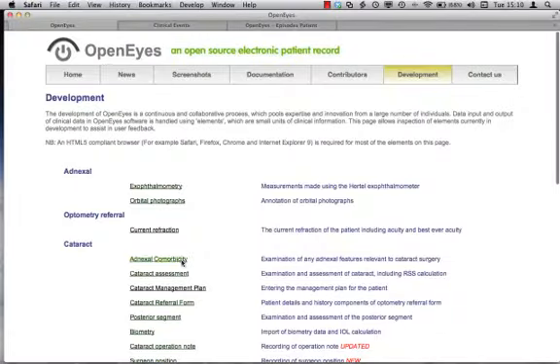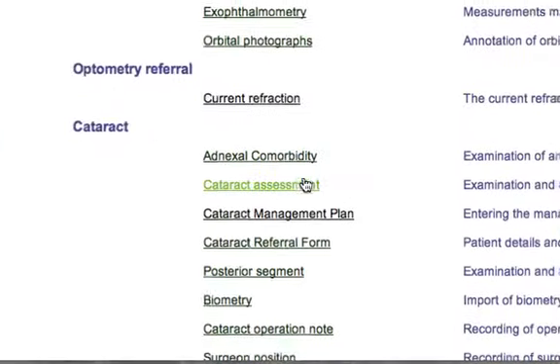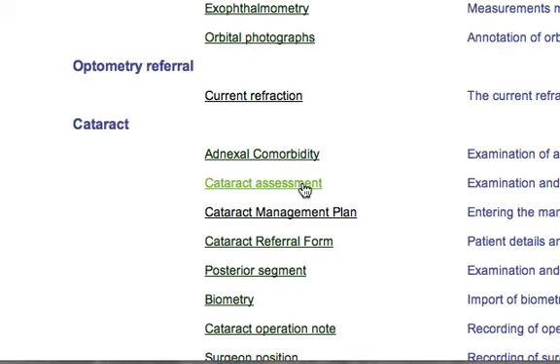If we go to a slightly more complicated element, cataract assessment, this is where you can imagine the patient is in front of you, you've examined them on the slit lamp and you're putting in information about their cataract.